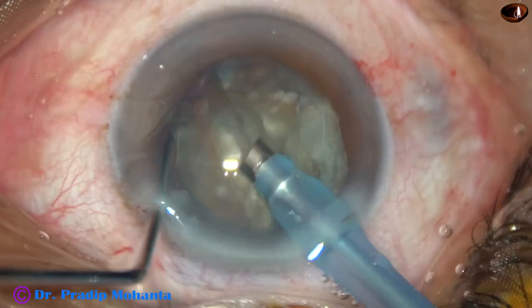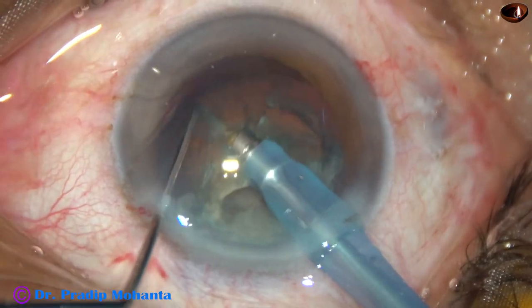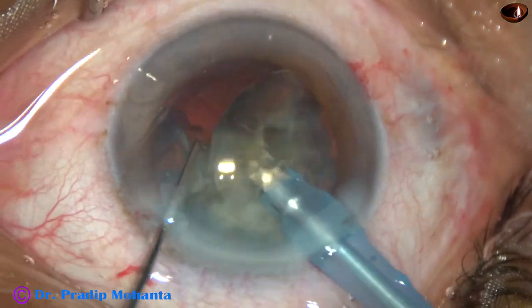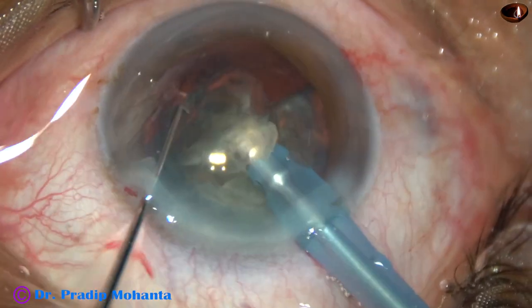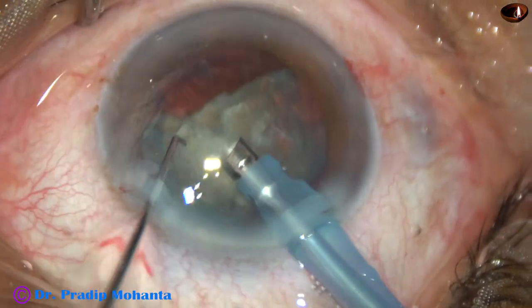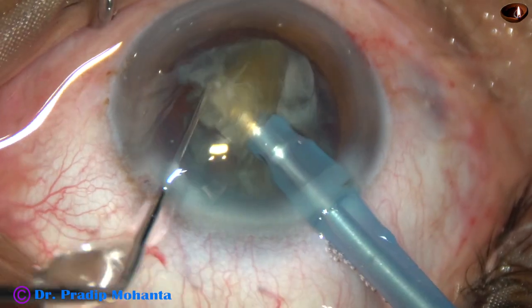Each heminucleus is divided into two parts in the same way — the phaco needle goes through the substance of the nucleus and it is chopped. The harder the nucleus, the more peripheral you can go. The softer the nucleus, you remain more central.